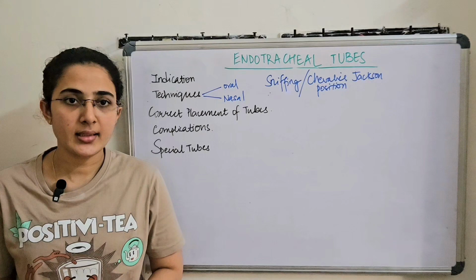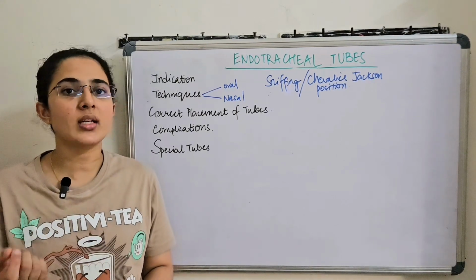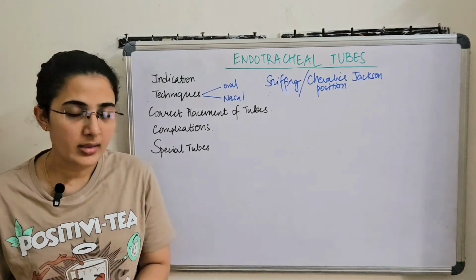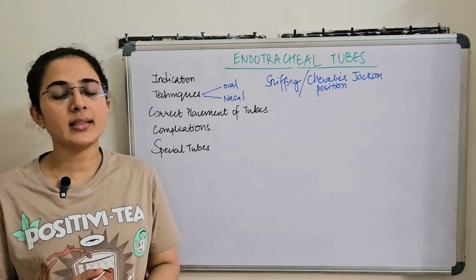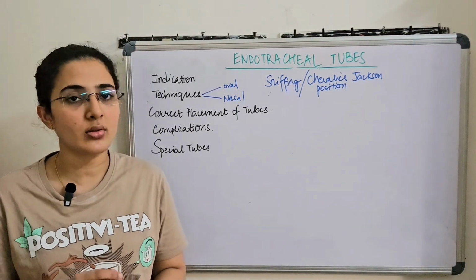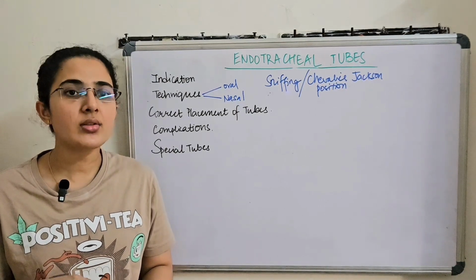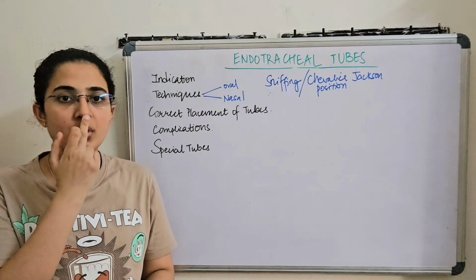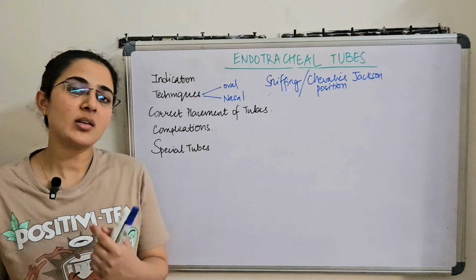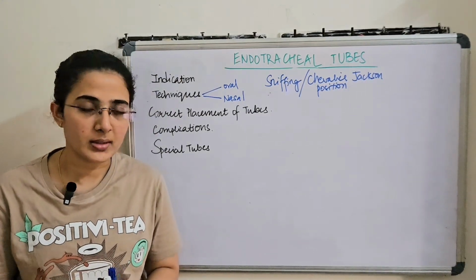Whenever we are doing a nasal intubation, we can gradually use nasal airways to dilate the passage so that we have an assessment of which size tube to pass. We generally observe that the tubes used in nasal intubation are smaller than the oral tubes. When we pass it through the passage, we push the tip up until it reaches the posterior pharyngeal wall. Later on, we can put in a laryngoscope and guide the nasal tube using Magill's forceps.